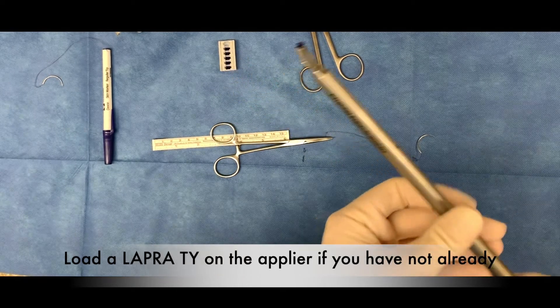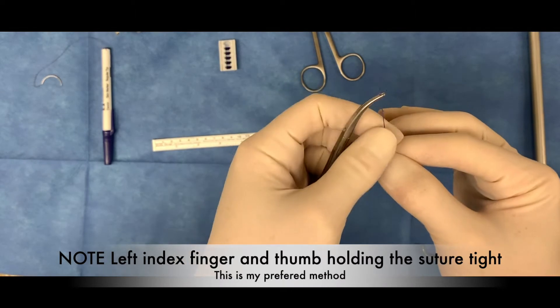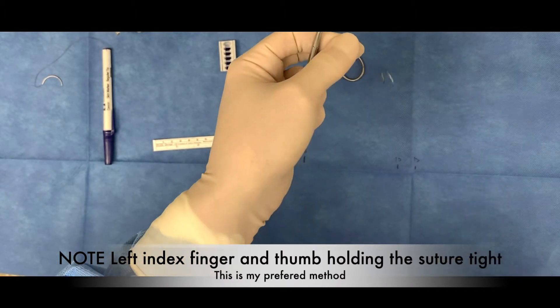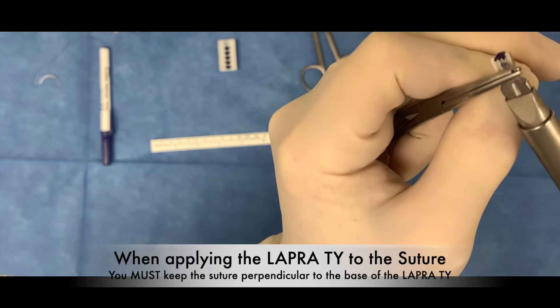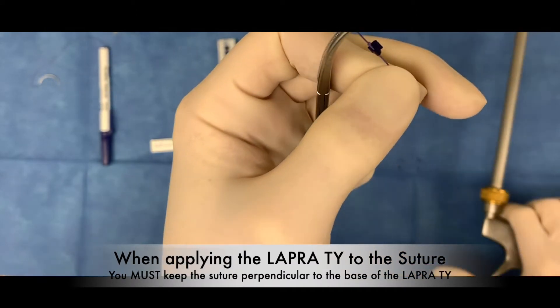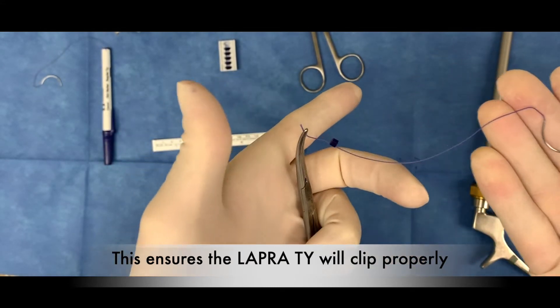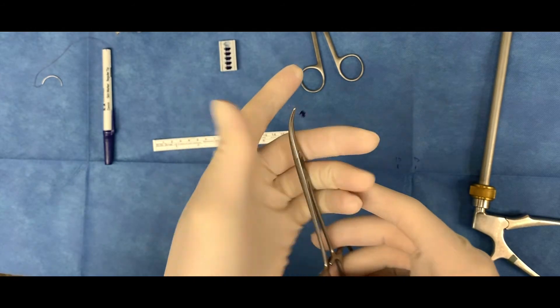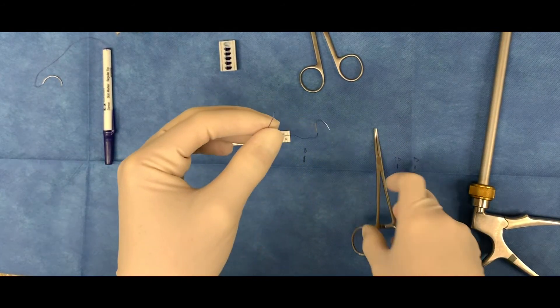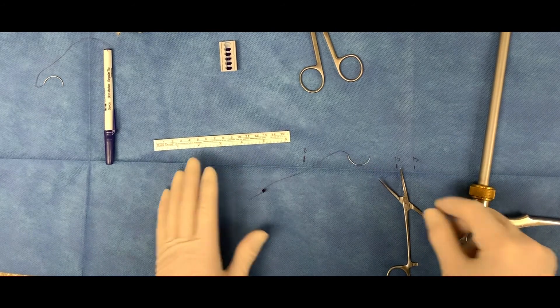When applying the Lapra tie to the suture, note the position of my index finger and thumb as it is holding the suture taut. The Lapra tie is being placed below the knot, and if you notice, the Lapra tie is actually placed on the side of the knot closest to the needle. The surgeon will advise you as to how many to make up for the procedure.